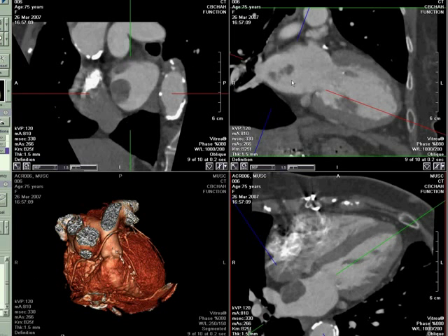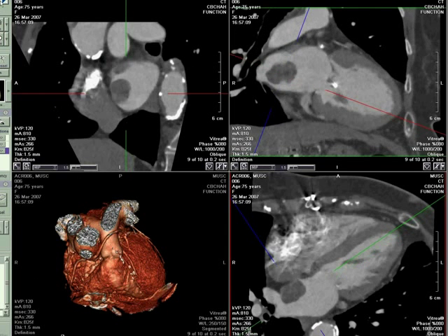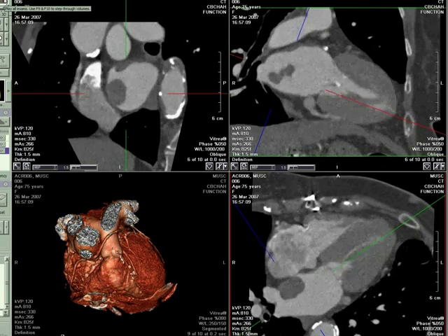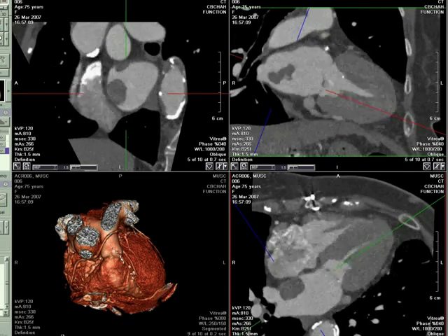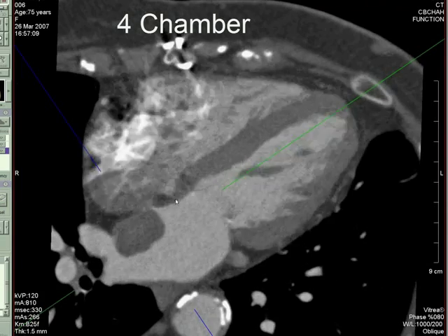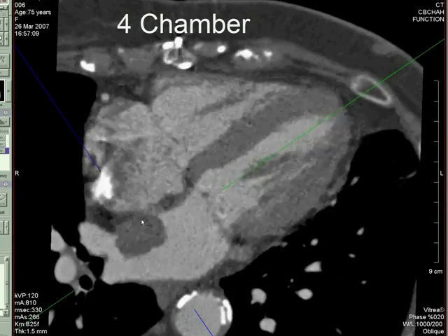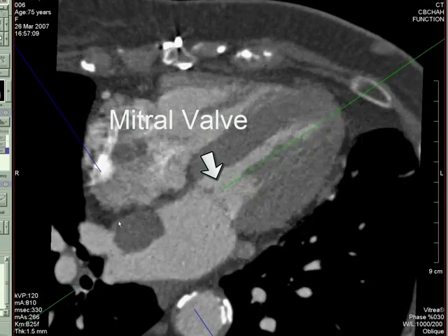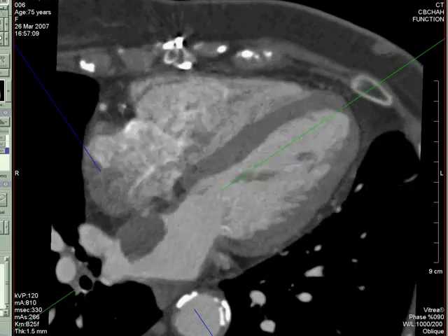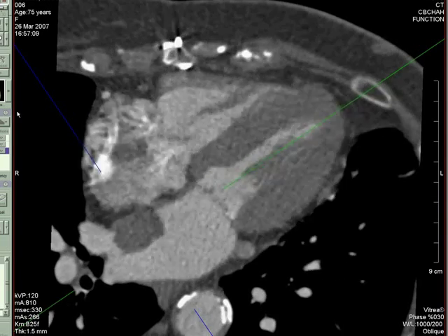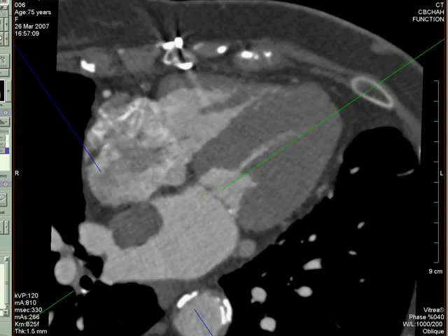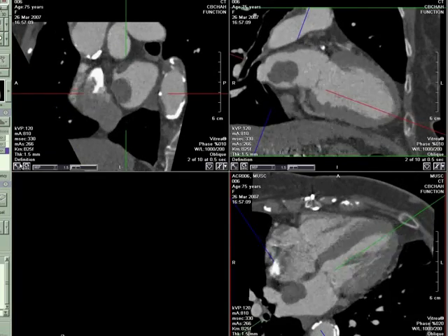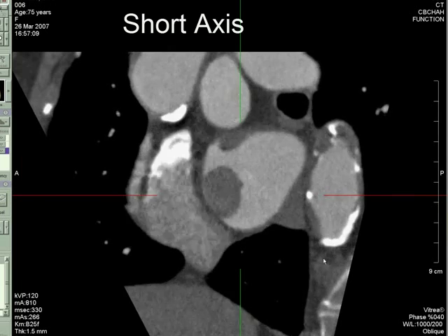We'll then look at the functional images to see if there's any motion of the mass. The four-chamber image shows that the mass does have a broad base, but does not move through the mitral valve annulus. It does not extend into either pulmonary vein, and respects the margin of the interatrial septum. This is again shown on the short-axis view.